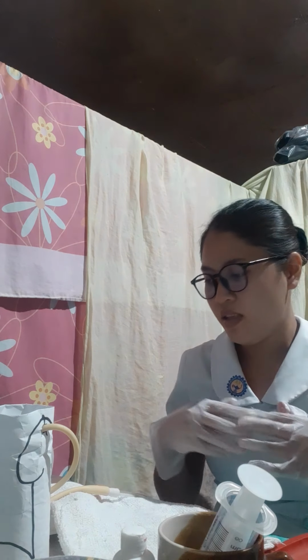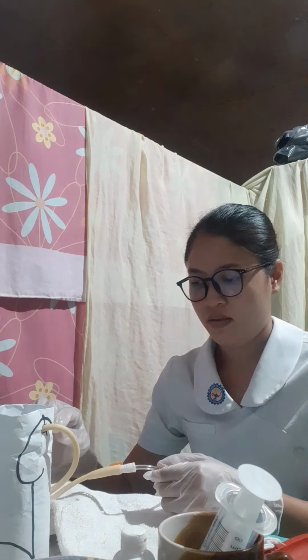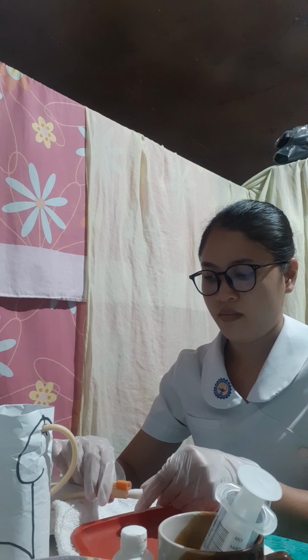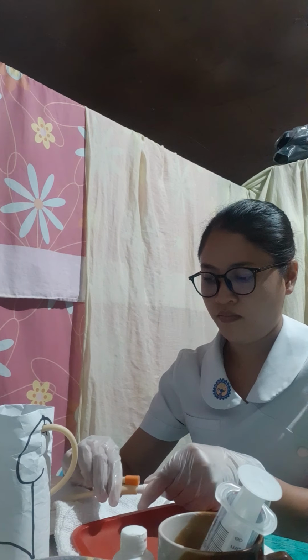And next, we're going to disconnect the catheter from the drainage tubing and place the catheter end in the sterile basin. And we are going to place the sterile protective cap over the end of the drainage tubing, this one.